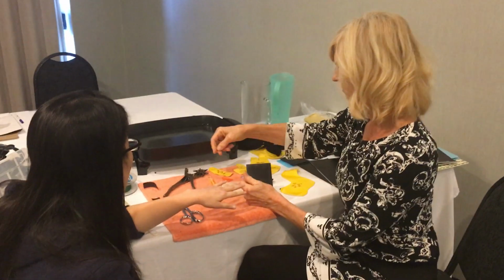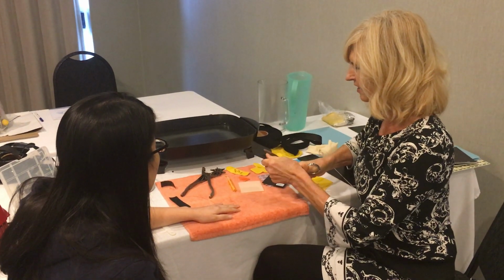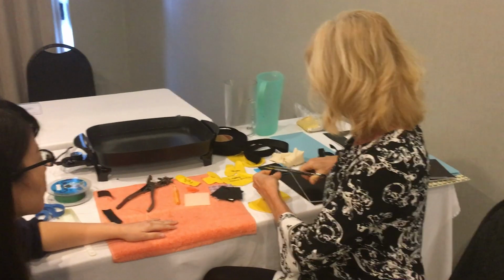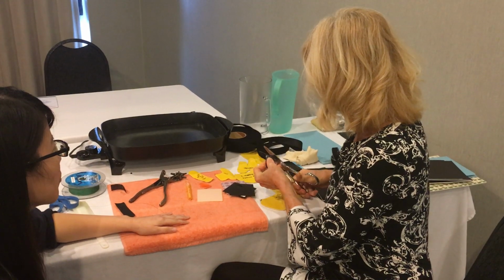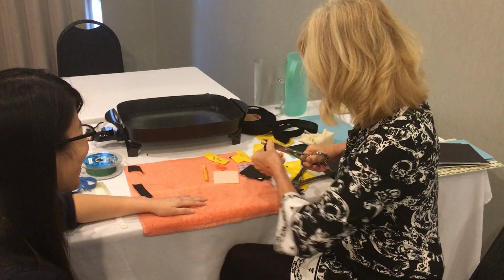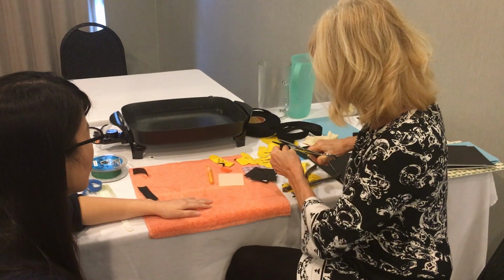So we're going to make some mallet injury splints. The first one is a splint that I like to make so that the patient can go in the shower, into a swimming pool or a hot tub, and not have to worry about getting straps wet. She's got a pretty tiny little finger, so I'll make it a little bit smaller for you.